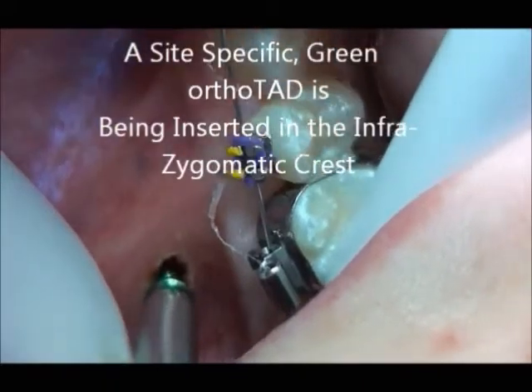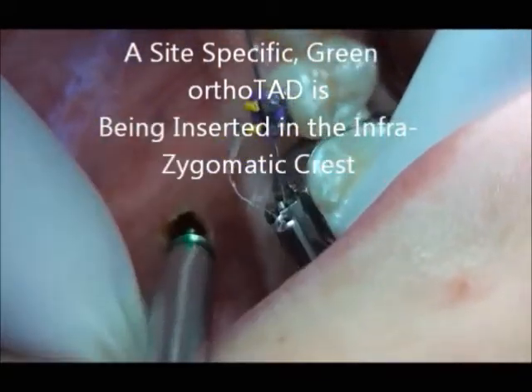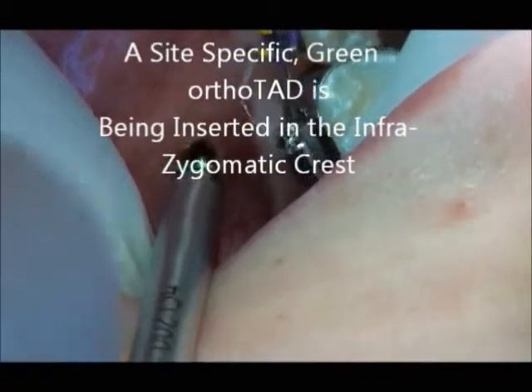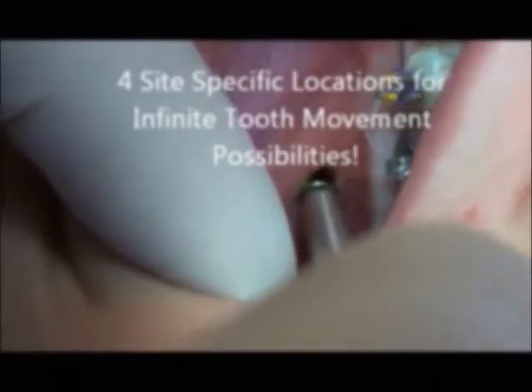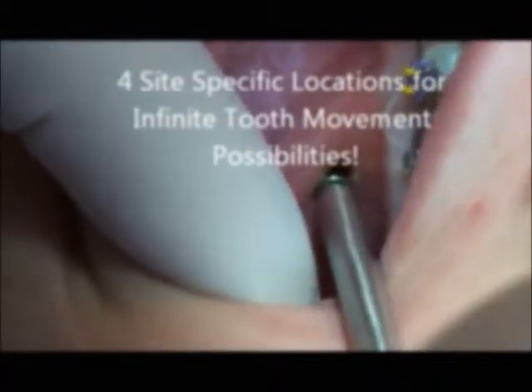A site-specific green orthoTAD is being placed in the infrazygomatic crest. Four site-specific locations provide infinite tooth movement possibility.